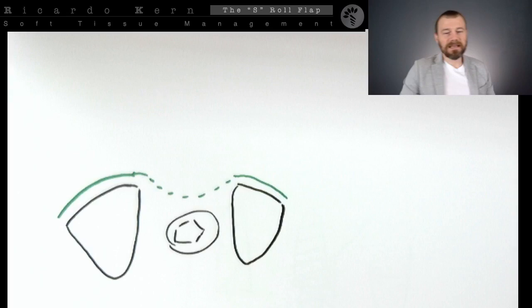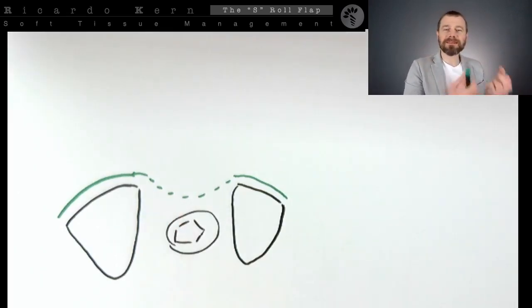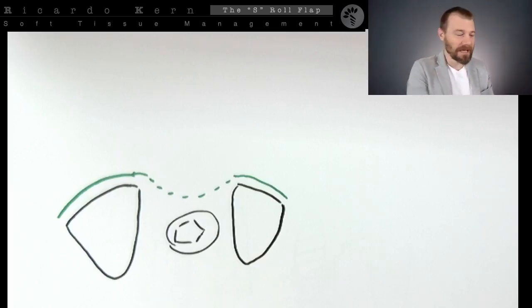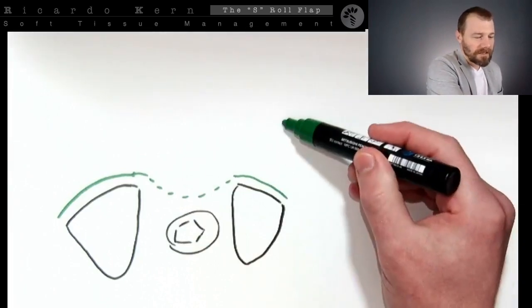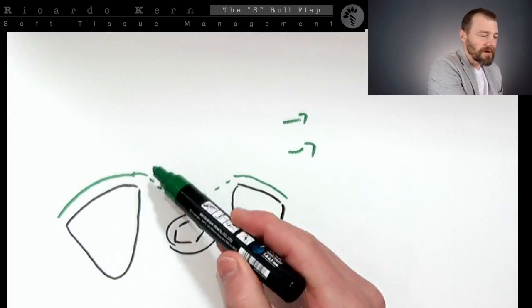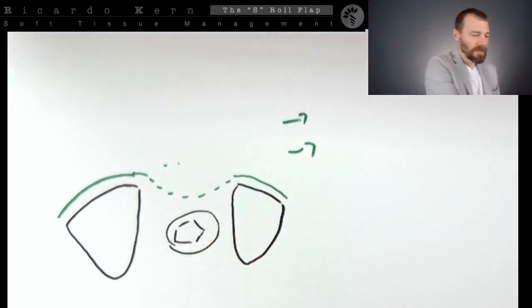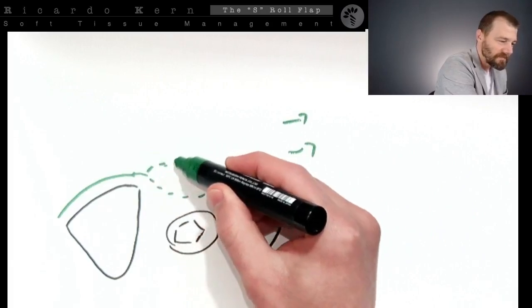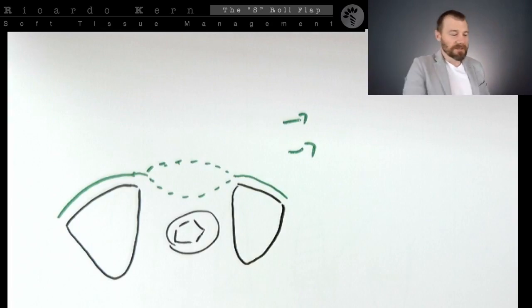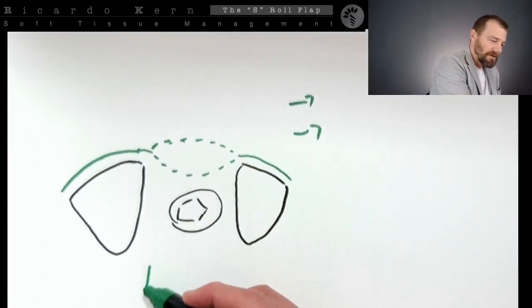And this is the easiest way for me to prepare the recipient area for a connective tissue graft. If you want to fix color change and volume here, what you are trying to do is bring the tissue here. Let's design the final contour. That is the idea, right? So you're going to bring in this area a connective tissue like this one here.